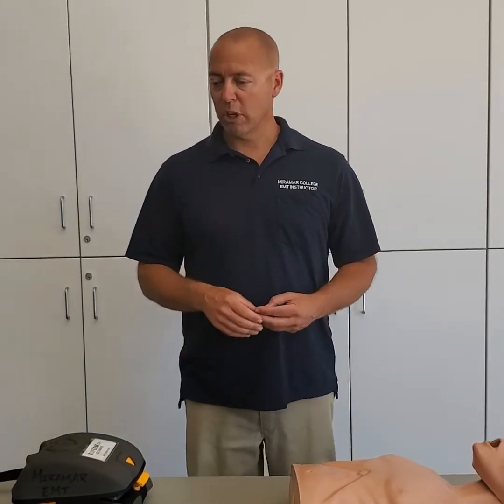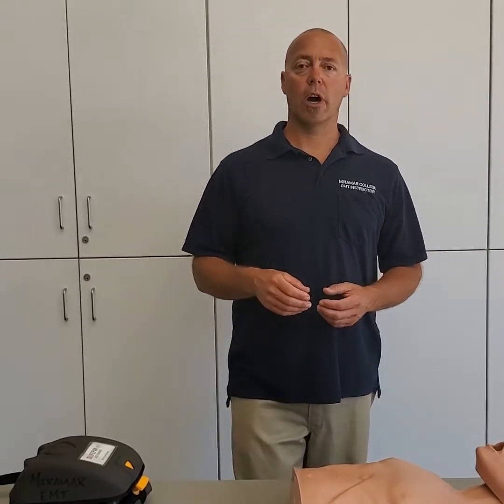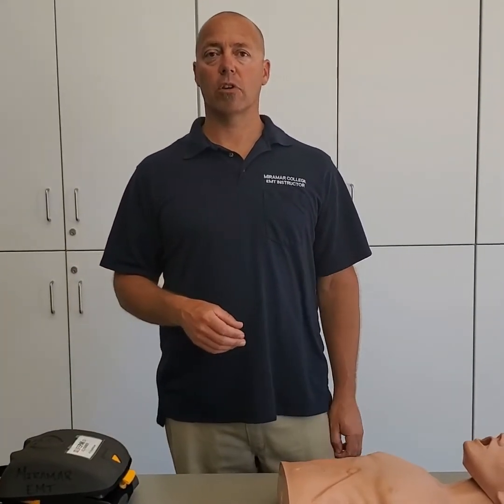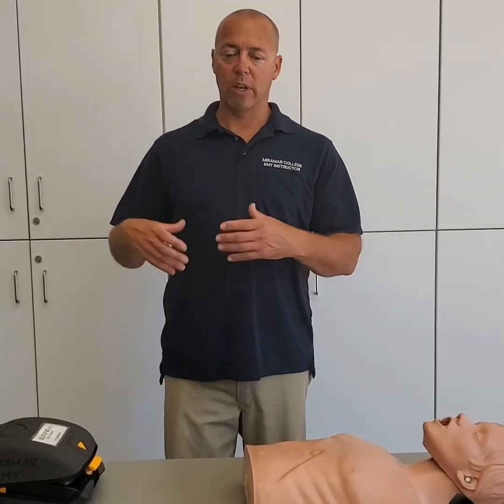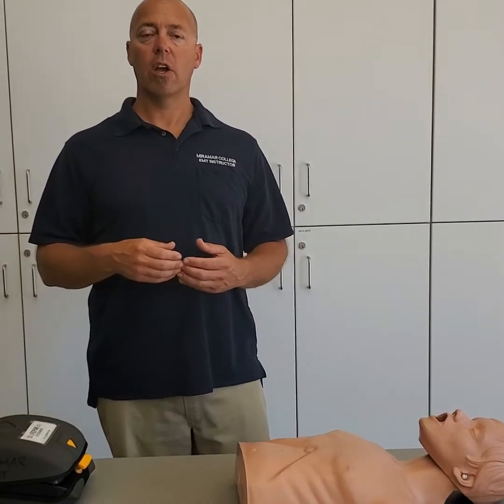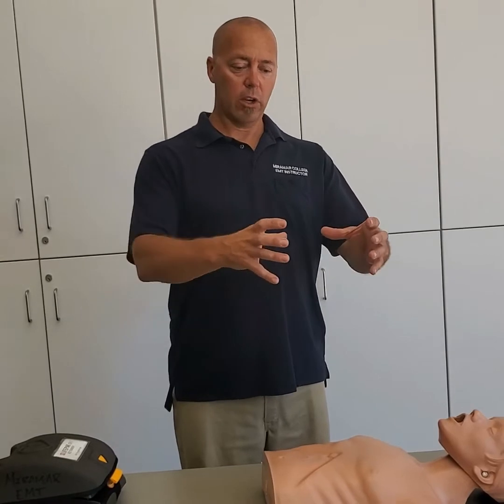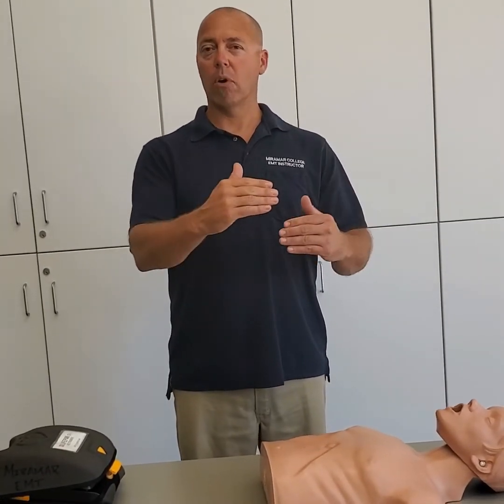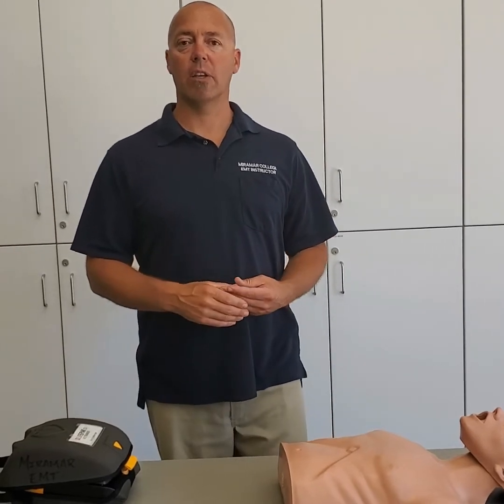So again, this machine is designed to shock ventricular fibrillation and ventricular tachycardia. When it delivers a shock, it actually stops your heart for a brief second. Your heart gets stuck in these rhythms, and the shock depolarizes your cardiac muscle, and the hope is that your heart comes back into a normal rhythm.